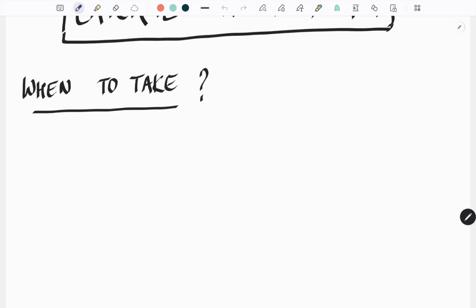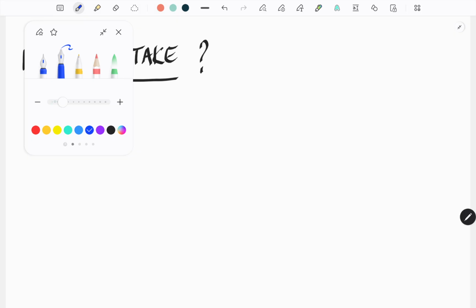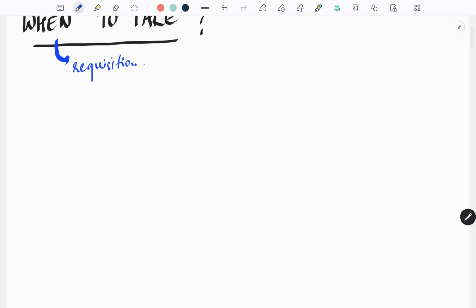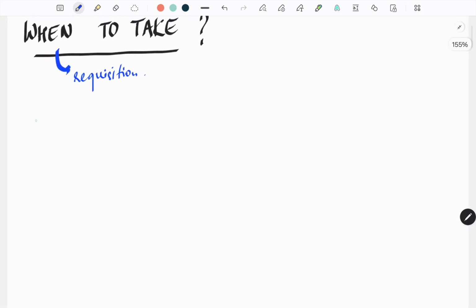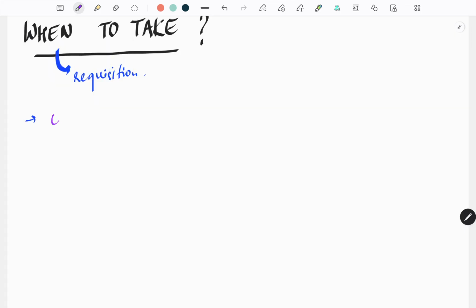First of all, we come to the question of requisitions: in which patient do we have to do it. First of all, if we have found an equivocal pathology on a frontal chest x-ray.